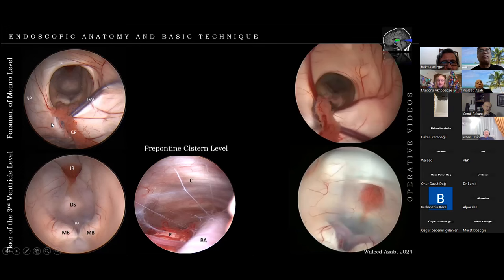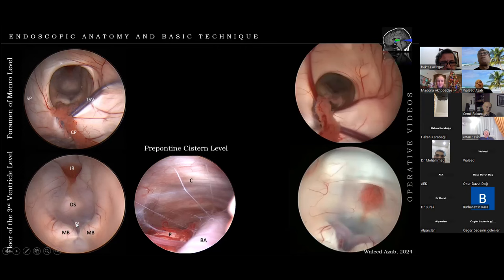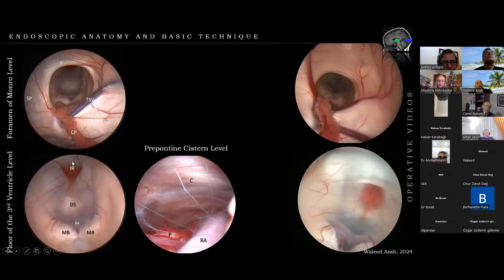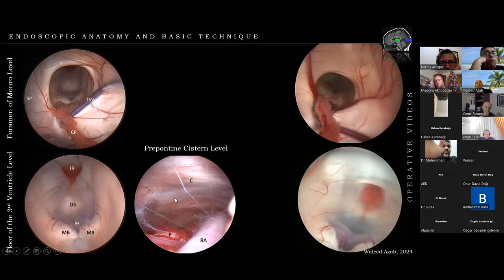At the level of the floor, we must identify the mammillary bodies and the basilar tip and its branches if the floor is transparent enough, as well as the dorsum sellae, the infundibular recess, and most anteriorly the chiasmatic recess. After opening the floor, the prepontine cistern level characteristically shows the basilar artery, the dorsal surface of the clivus, the pons, and the perforators.